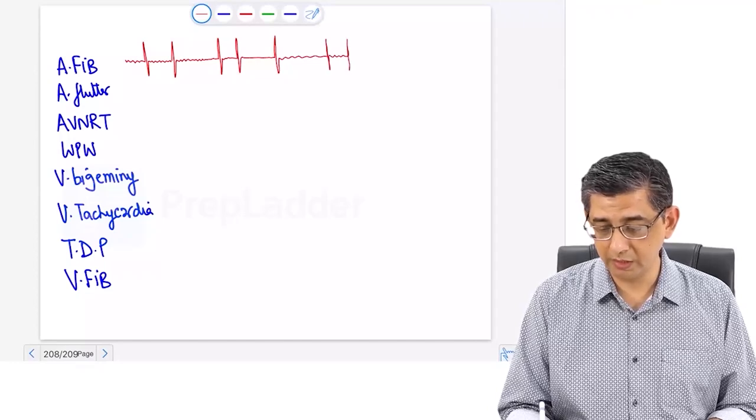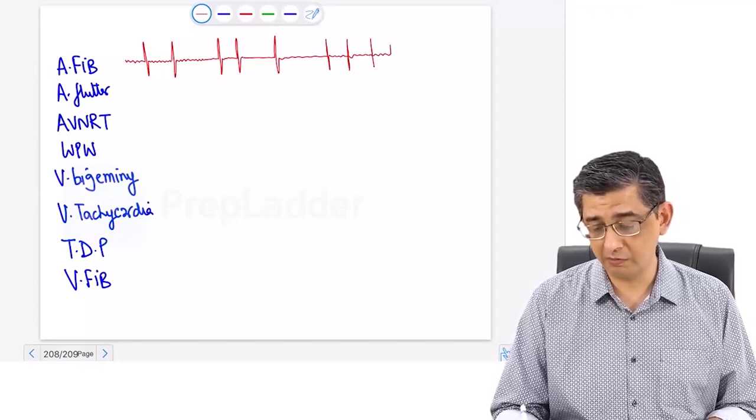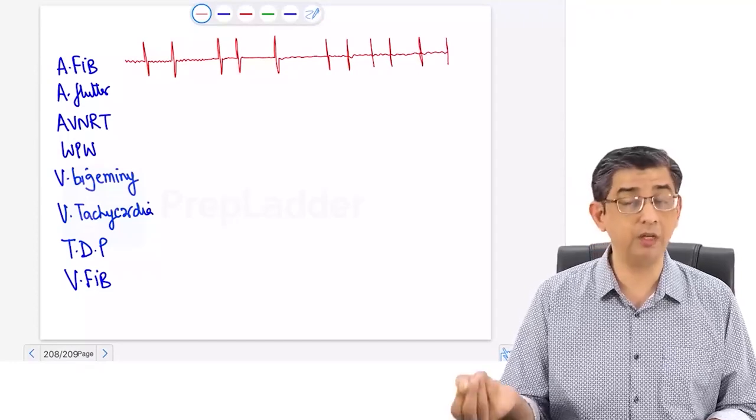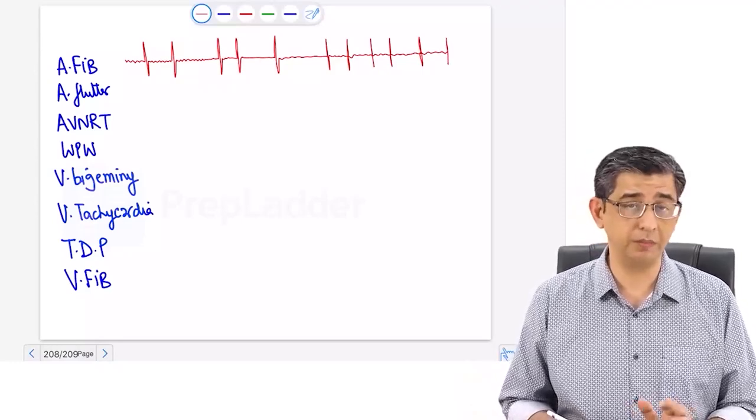That's the peculiar thing that you will notice, that the heart rate was 200. Then it changes to, let me say, 133. Then it changes to 150. Then it again upgrades to 200 and then can become normal also. So atrial fibrillation is one of the easiest ones to be picked up.